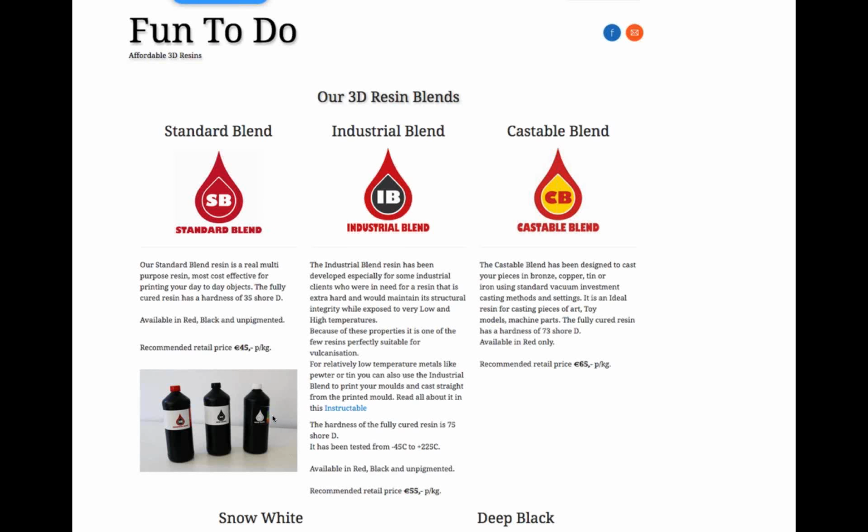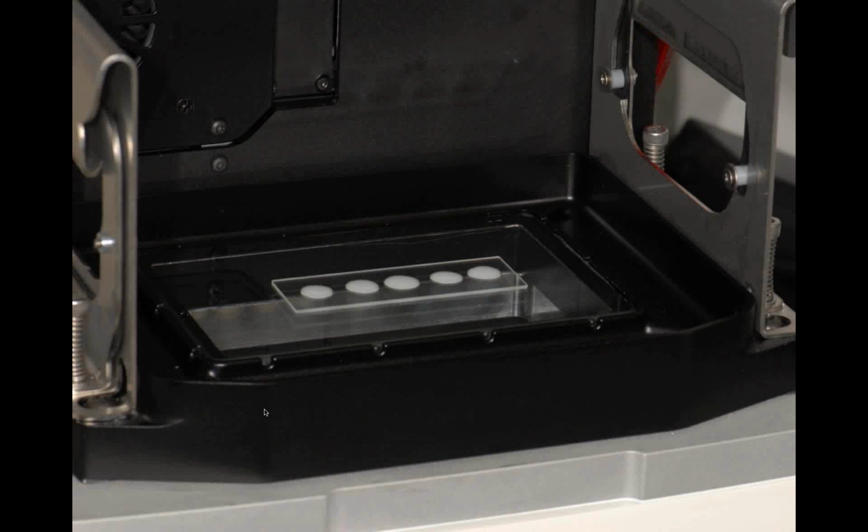and they also have colorants you can drop in, yellows and browns, to tint it like you want. But be aware, these resins are not FDA approved for intraoral, all right? And the implications of some of these third-party resins, you really need to do your research about what's in them and are they okay to use if your plan is to do things intraorally with them. However, any resin that's out there, like I said, the exposure of the layers is absolutely critical.